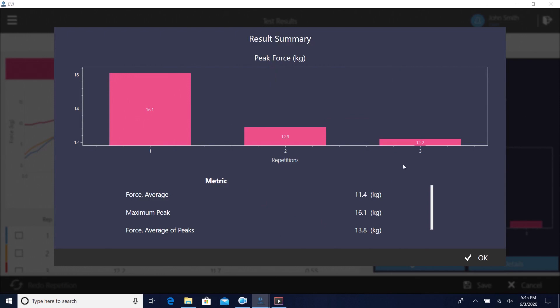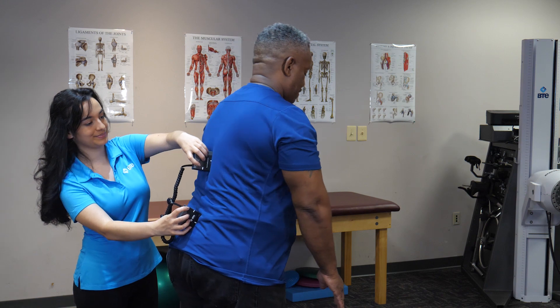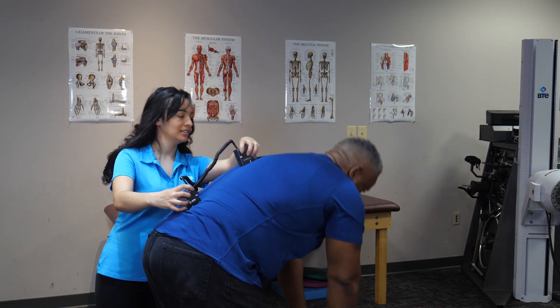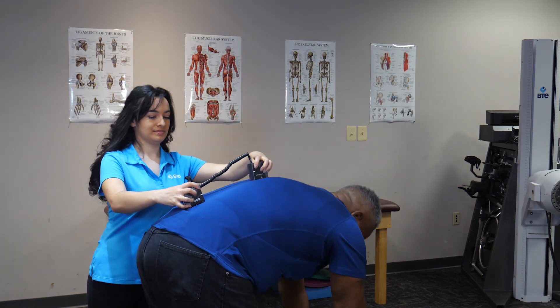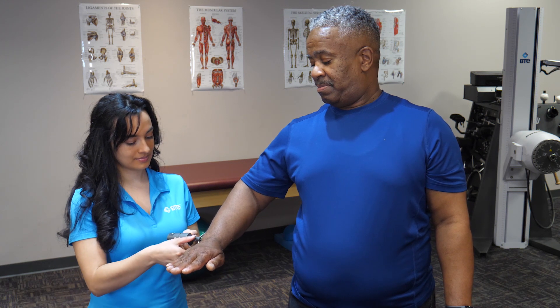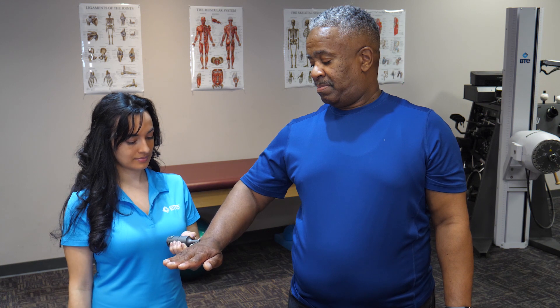Get exact reports that are easy to export and share. The EVJ's dual inclinometer can measure range of motion in any direction. It also eliminates any compensation from the client so your data only shows the true quality of the client's movement. Use the dual inclinometer to measure gross motor functions like bending the lumbar spine. For the movement of joints like elbow, wrist, knee, or ankle, the EVJ goniometer provides precise measurement.